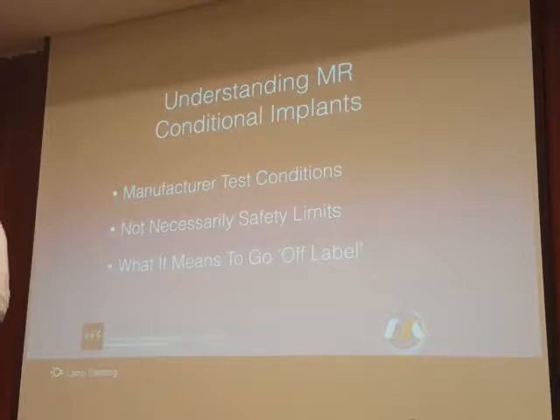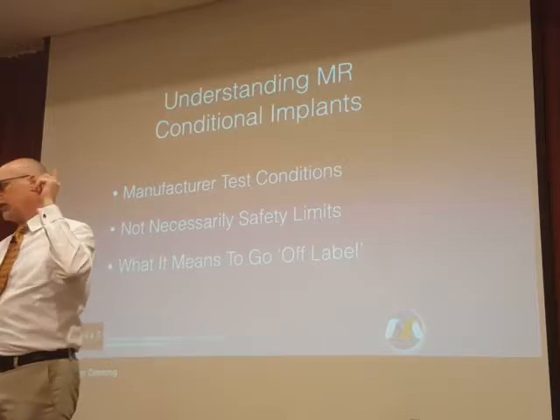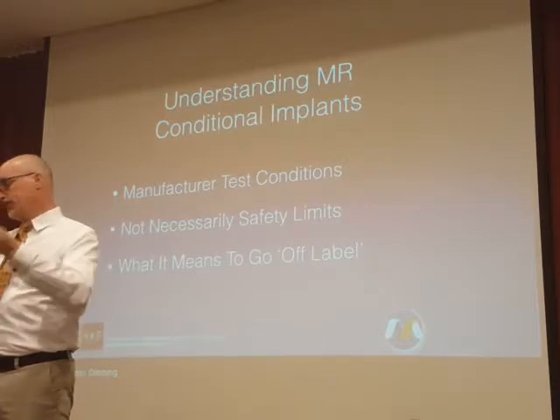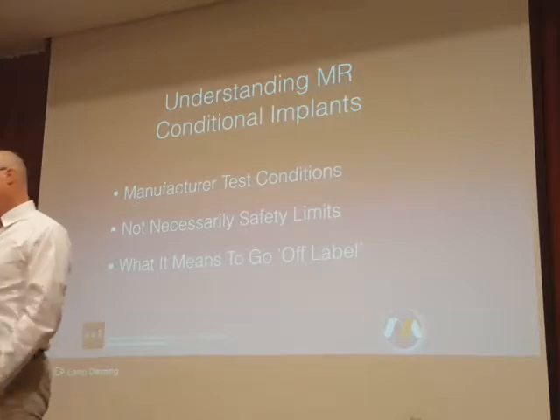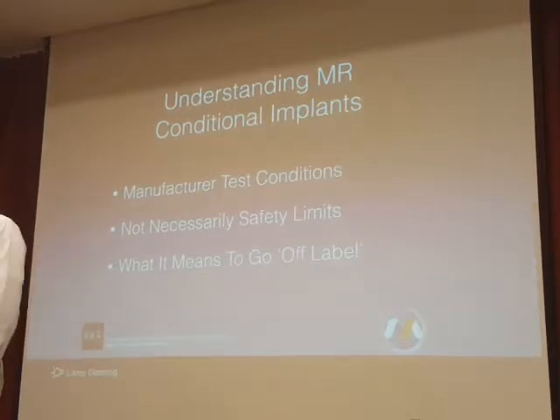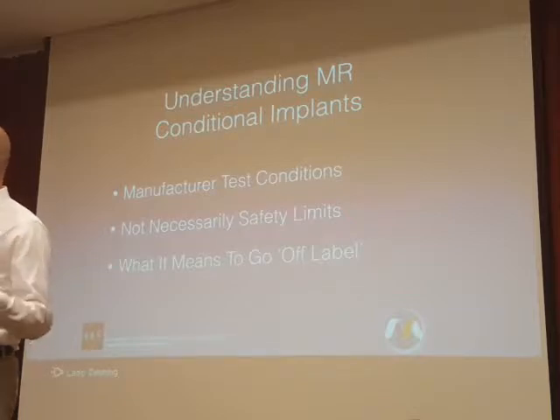That's going to depend on the individual device and what that manufacturer describes. Before the break, I made mention of Boston Scientific, that for their MR conditional pacemakers, they now have ones that, if it detects a strong magnetic field, automatically switch into an MRI safe mode.